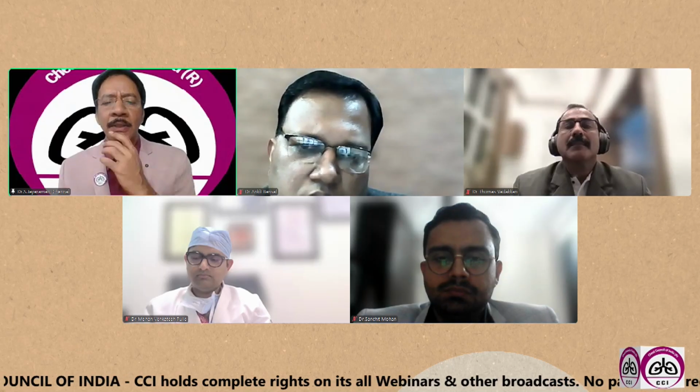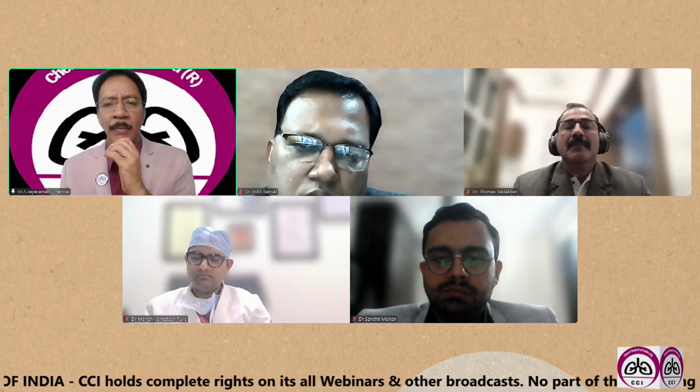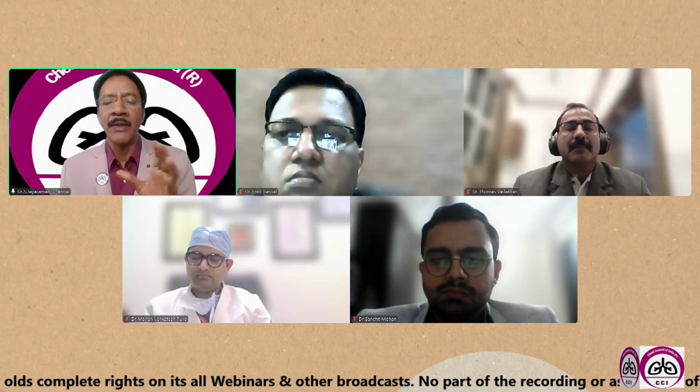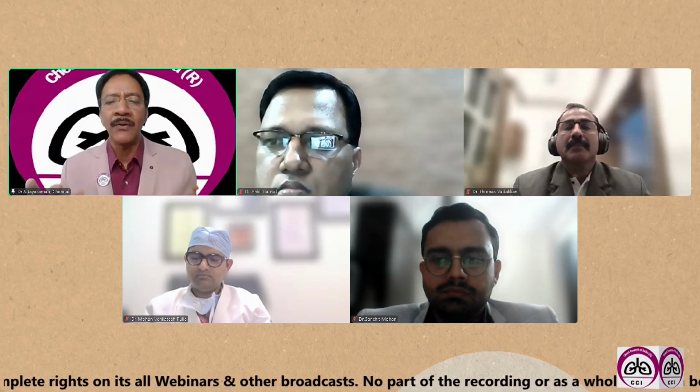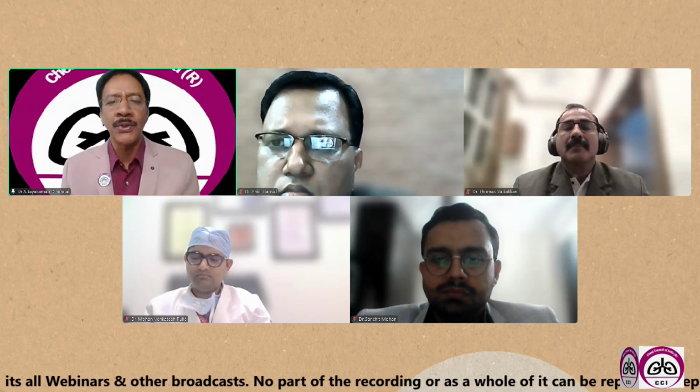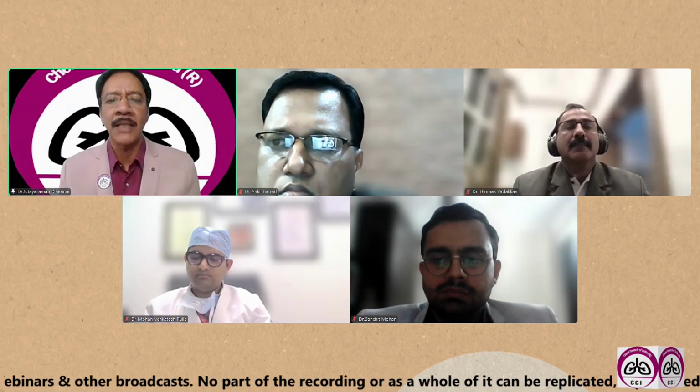Already Thomas had mentioned that. Bleeding is one of the complications. Always we have to use the Doppler. Despite that, some of the bleeding we have to tackle effectively. So we have to have all the backup facilities, ice saline and other methodology to arrest the bleeding and other complications. Thank you.